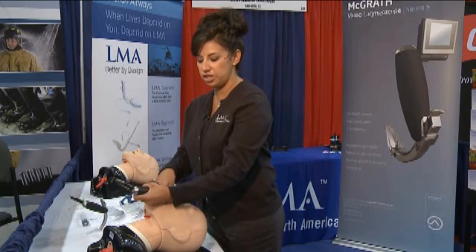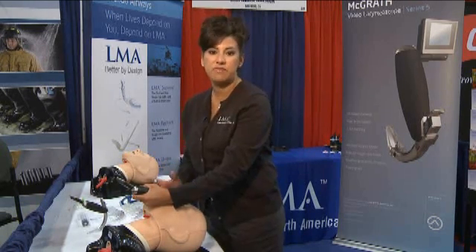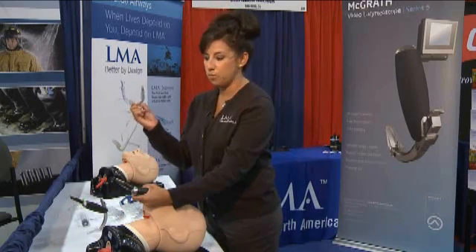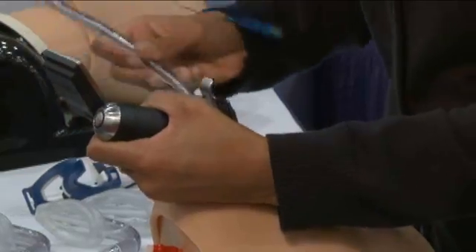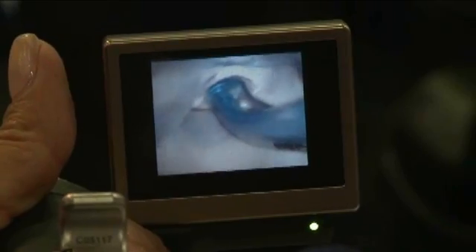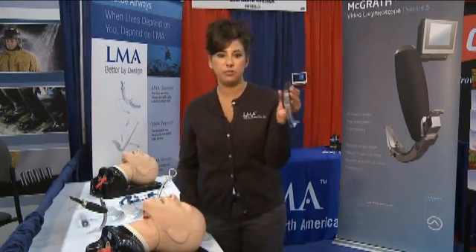You'll see the uvula, then you put your tip into the vallecula and you visualize the vocal cords. As you can see, it's a minimally invasive way to intubate your patient. Then you take an endotracheal tube with a stylet and put a little hockey stick bend on the end, come in from the side, and you're able to intubate your patient. And that's the McGrath Video Laryngoscope.